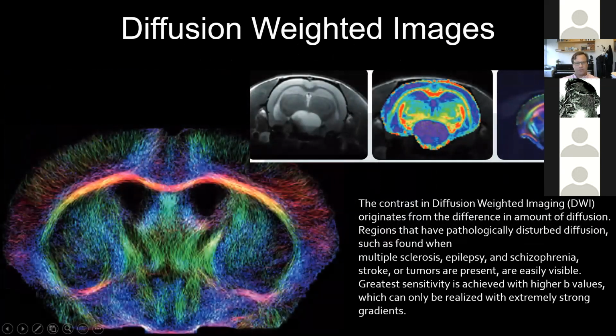Diffusion weighted imaging really digs down into the diffusion of water in tissues, and actually allows you to measure that spatially and map it out. And there's a lot that can be done from a research standpoint in terms of addressing specific questions.